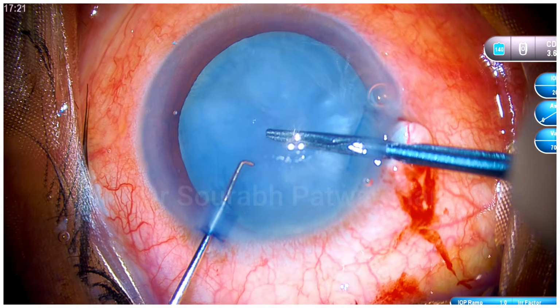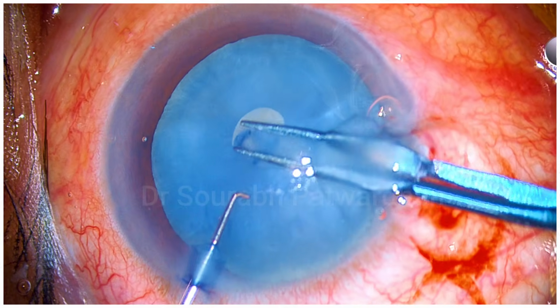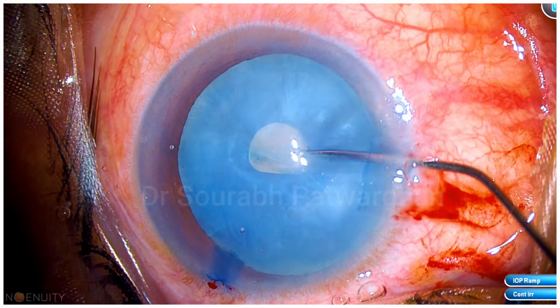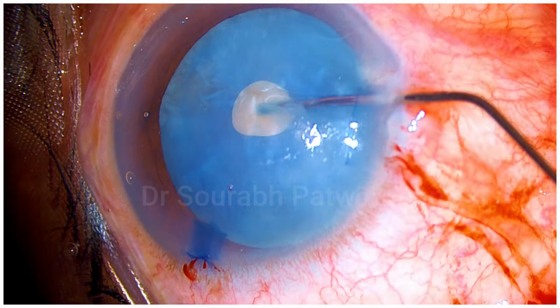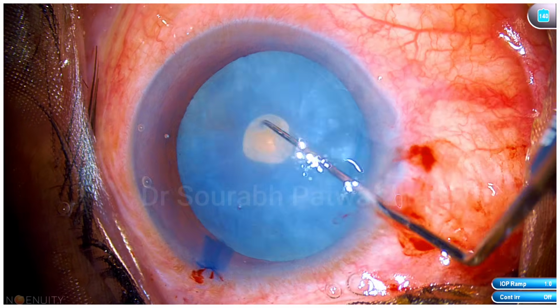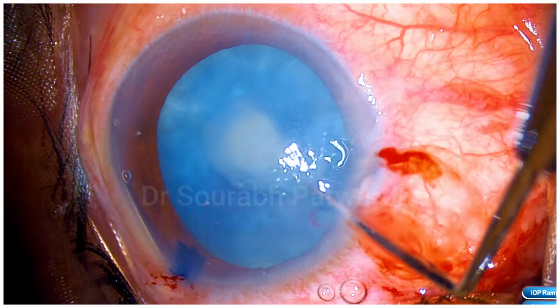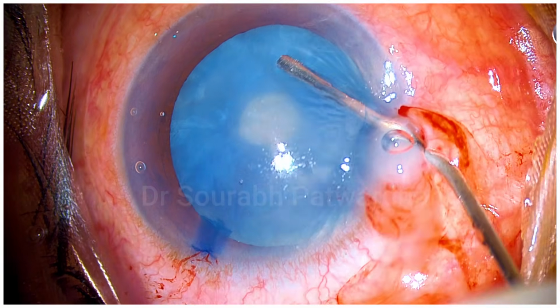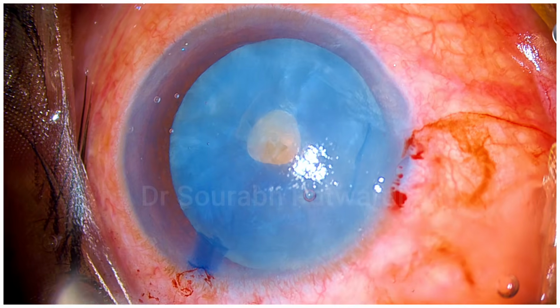Now let's look at another case where intumescent cataract is tackled by double rhexis or two-stage rhexis technique. And first, a small rhexis is made. It's just 1.5 millimeter, and then we aspirate the cortex, liquefied cortex. Then we rotate the nucleus so that all the liquefied cortex is released. After this, we make a tangential nick. So even these steps before doing capsulorhexis help in mitigating the risk of extension. These are not needed in a routine case, but for an intumescent cataract, it becomes important.